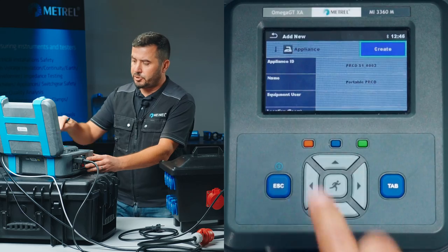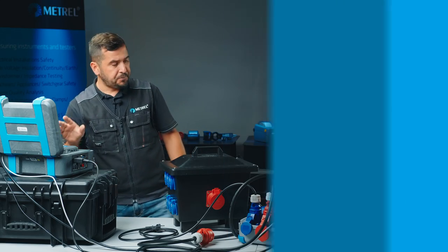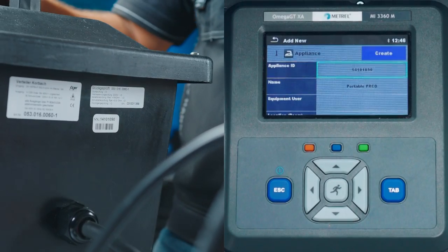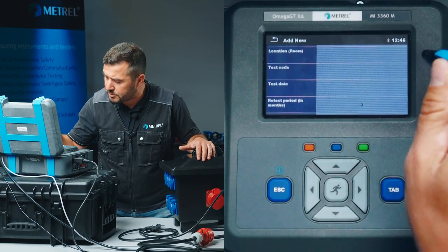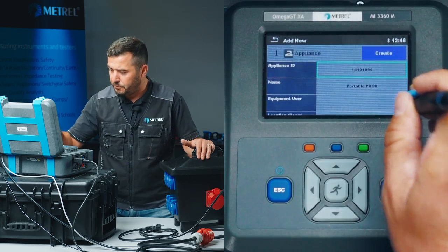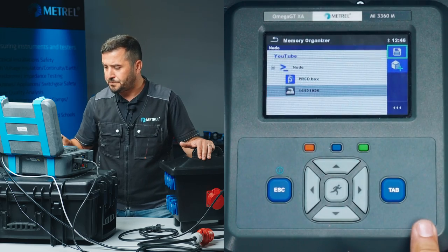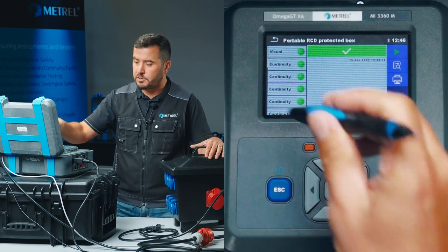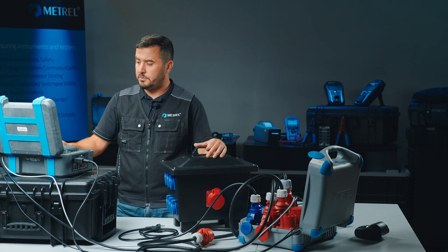We see that this is a structure element 'Appliance'. We have already inserted the name 'Portable RCD'. We will also insert the device ID by using the Bluetooth scanner — we simply scan the label and we see that the ID number is already populated. We can also adjust other parameters such as retest period, location of the device, and other parameters if needed. If we are satisfied with this data, we press 'Create and Save'. The complete test results are now stored under these structure elements and can serve for printing of professional test reports.